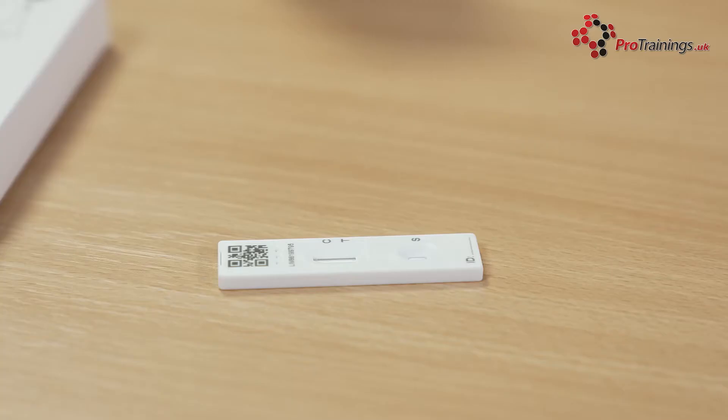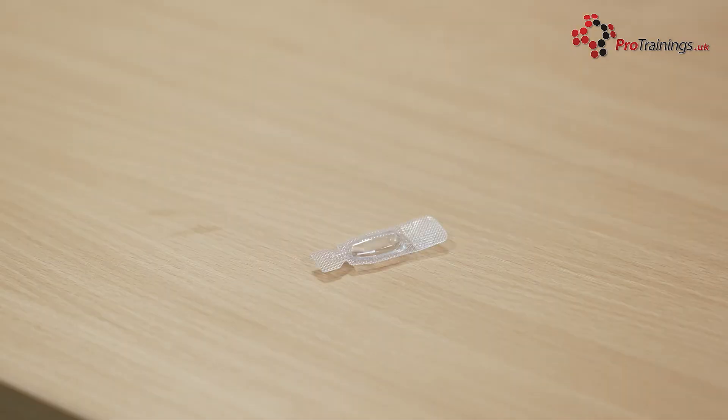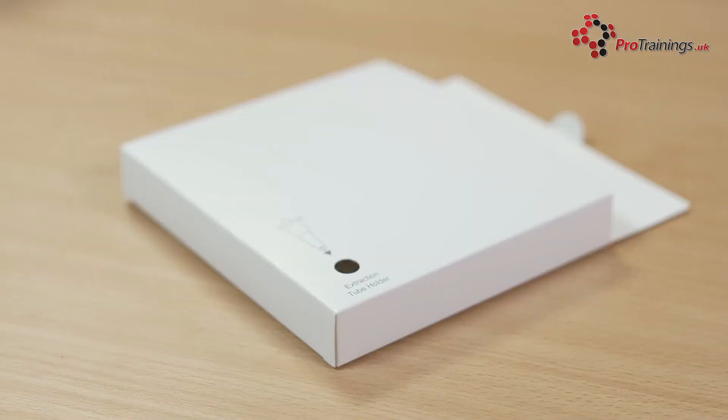Check the contents of the kit. The kit contains a test strip, a swab inside a sealed wrapper, an extraction buffer sachet, an extraction tube, an extraction tube holder, and a plastic waste bag.